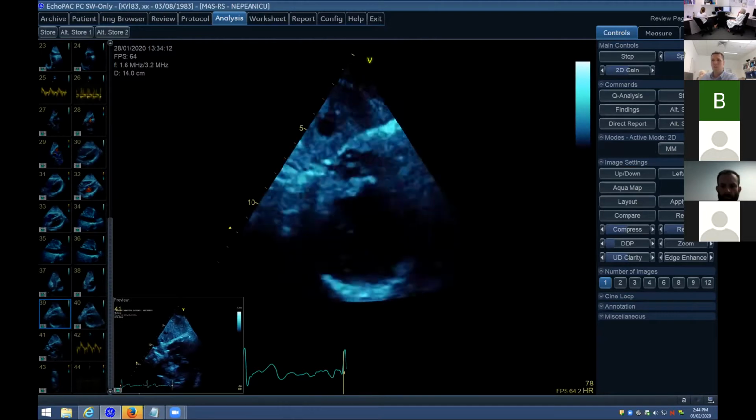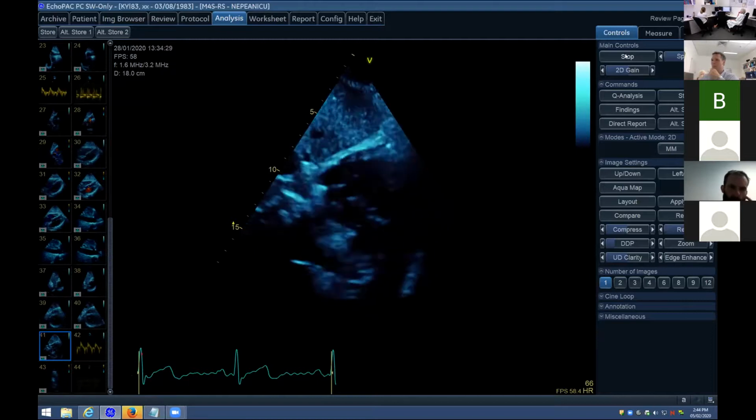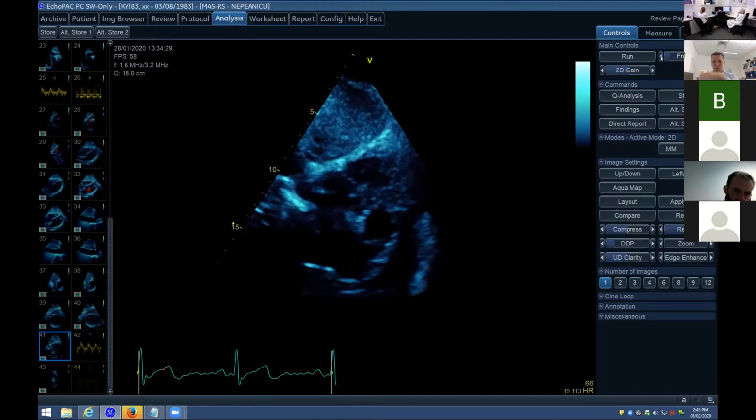And although she didn't actually record the picture, I'll just show you this one where you can see her starting to fan up. And if I pause it at the right part, I'm just going to scroll it back a little bit. So this in the short axis, scrolling up from the mitral level. And here you've got the aortic valve in the middle, the RV wrapped around it. There's the tricuspid valve at the top. And here's the pulmonary valve and pulmonary artery, excuse me. And this is a really nice view. You can actually get quite nice Doppler angles down there through the RVOT to measure things like, seeing if you've got the flying W sign or signs of pulmonary hypertension.